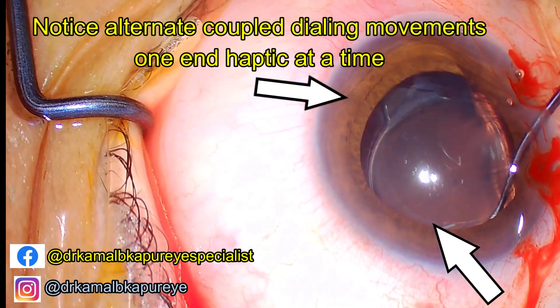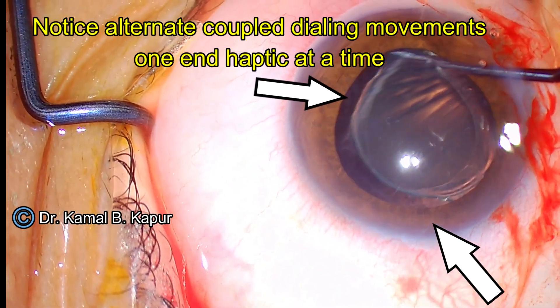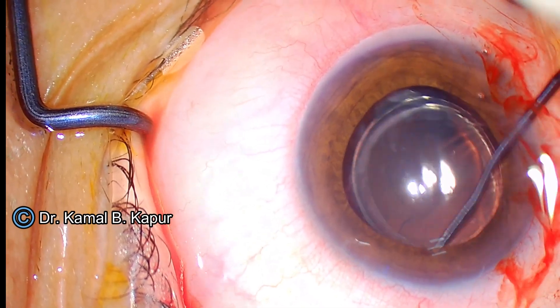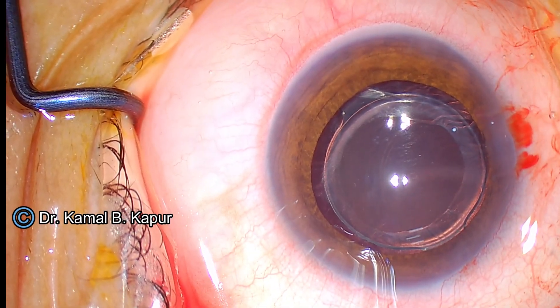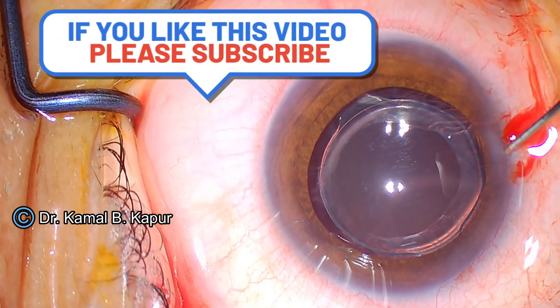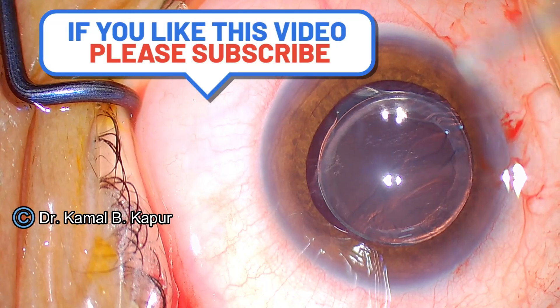The same movement is done at the same time from the opposite side. Each time I rotate the haptic on one side for a coupling effect, I repeat the same movement on the opposite side. If all the forces are exerted on one side of the haptic, we could have an asymmetric pull, and the non-coupling effect could end up breaking the zonules on that area.